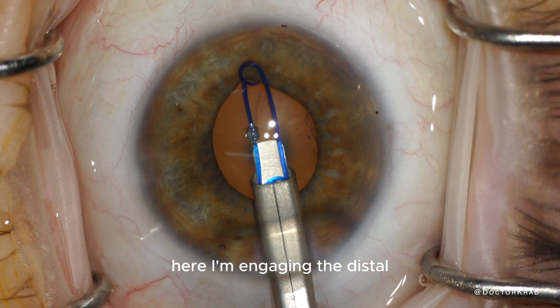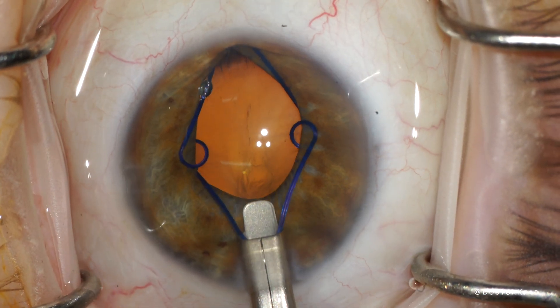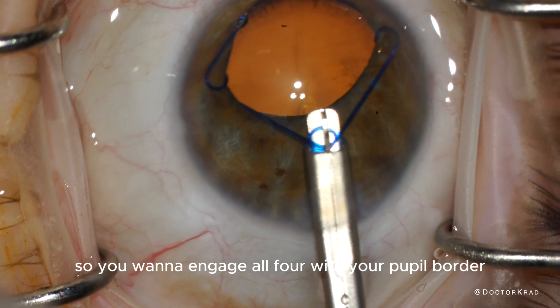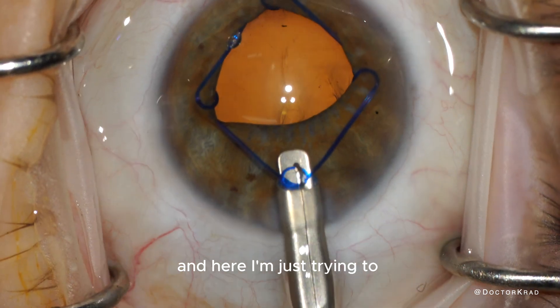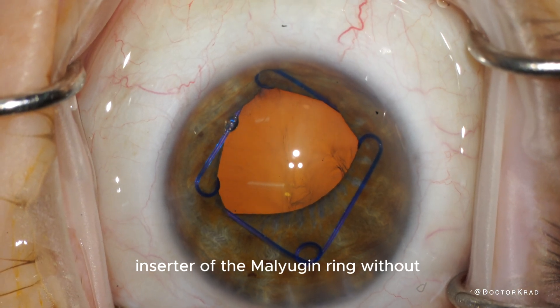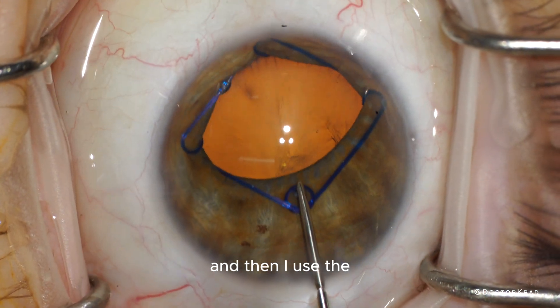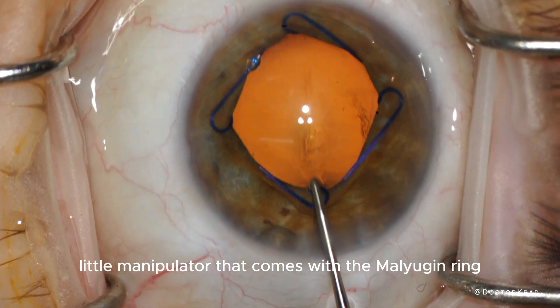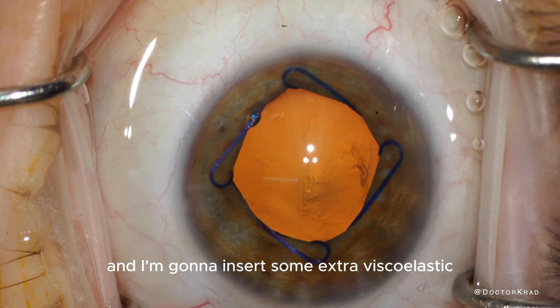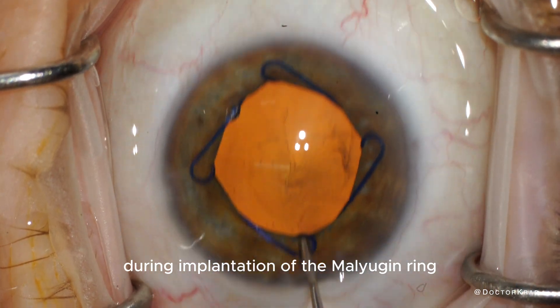Here I'm engaging the distal loop of the Malyugin ring with the pupil border and the iris tissue, and then the right and left loops with the pupil border. The Malyugin ring has four loops, so you want to engage all four with your pupil border. Here I'm manipulating it to retract the inserter without trapping the proximal loop. Then I use the little manipulator that comes with the Malyugin ring — it's basically like a Lester. I'm inserting some extra viscoelastic because some always escapes during implantation.